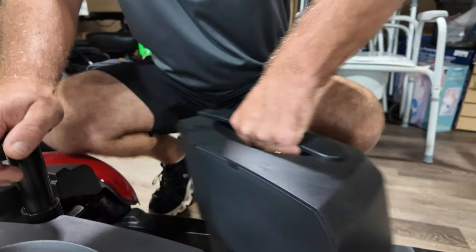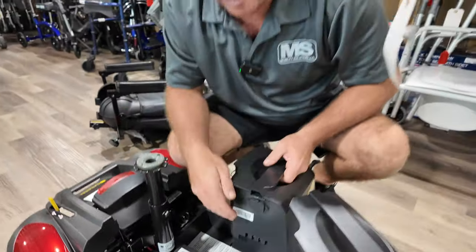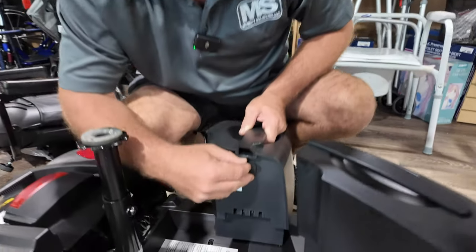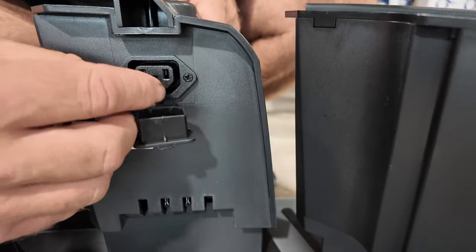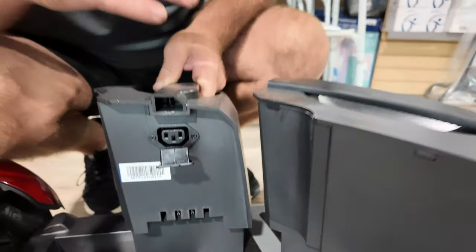Remove the battery — here's one battery, here's two batteries. Some scooters will have both batteries inside their battery packs. This has U1 batteries and gets you up to 18 miles. Right here is a port where you can plug in your Y cable that will come with it when you buy this from us, and you can charge these batteries up inside your house.